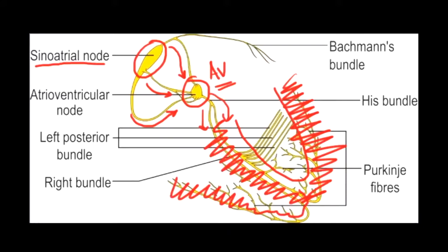So that again is sort of the map of this cardiac conduction system. And really it's this cardiac conduction system that allows the depolarization to occur in such a nice and timed way. Now, on an EKG, when we're actually looking at the electrical depolarization, are we actually seeing the electrical movement down this conduction system? The answer is no. This is such a small amount of electricity that it's almost imperceptible on an EKG.